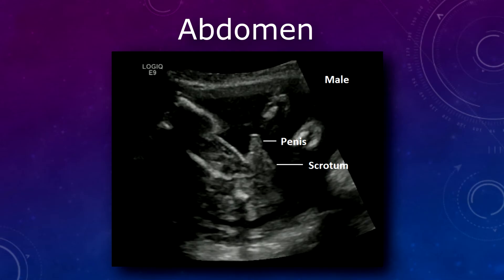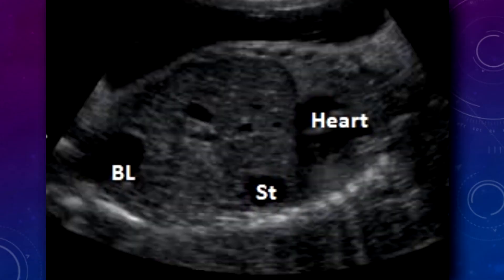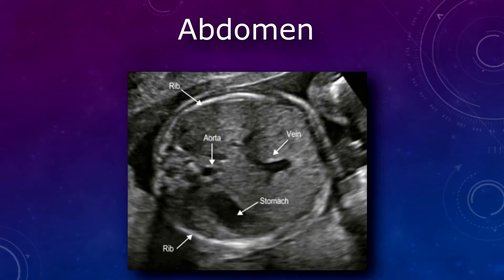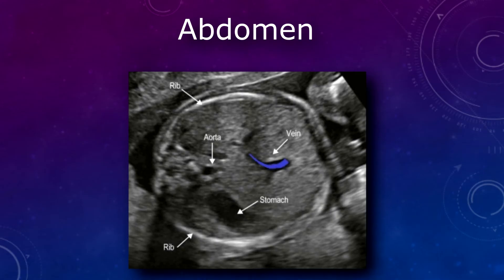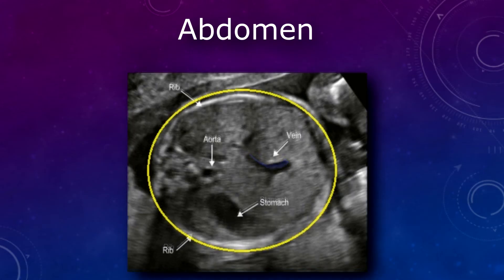Next up is the abdomen. In the abdomen, you have your third measurement, which is the abdominal circumference. You can also do a coronal view of the fetal thorax and abdomen to get the heart, bladder, and stomach view — you can rule out things like heterotaxy or situs inversus. Once you're transverse on the abdomen, above the level of the cord insertion, you want to get the umbilical vein becoming the portal vein, which forms a J-like shape, along with the spine, liver, and stomach. Here you can measure the abdominal circumference.